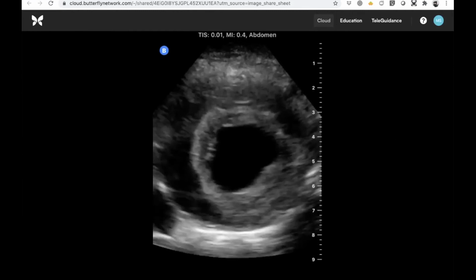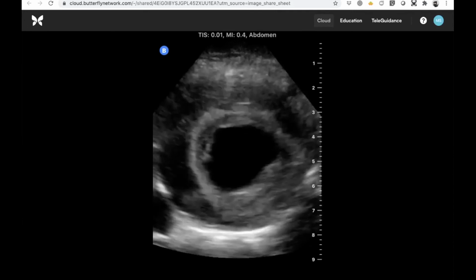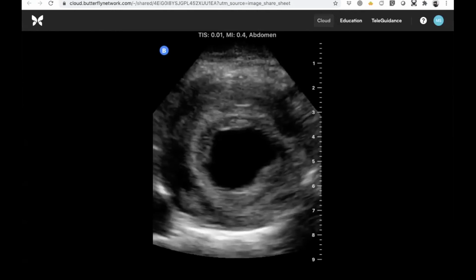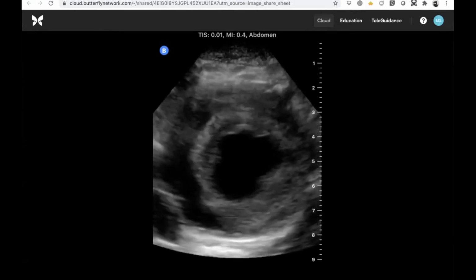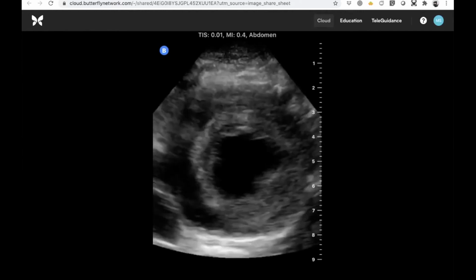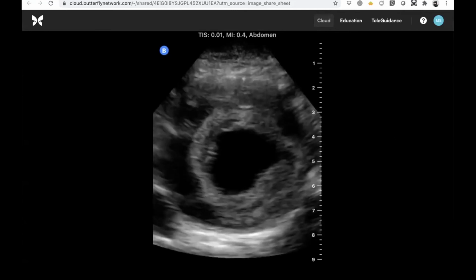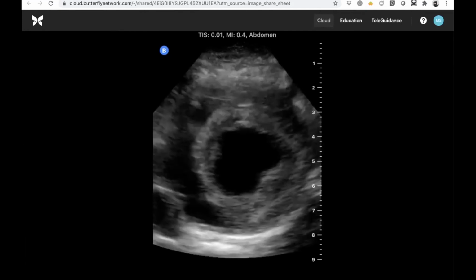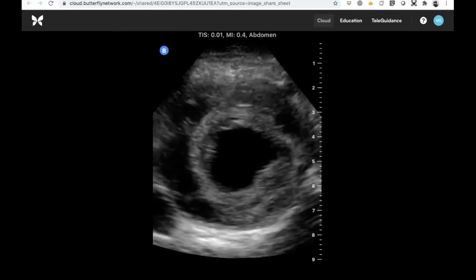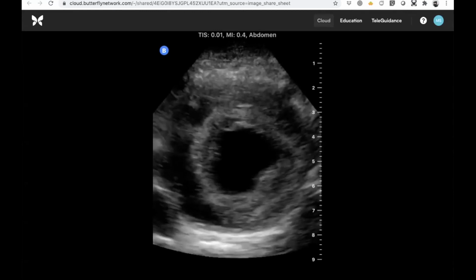Yeah, 100% agree. I worked closely with a trained sonographer who was also a vascular technologist and an ultrasound technologist who said you haven't seen a structure until you've seen it in both planes. And I think that's a great tip. That's the kind of stuff that will stop you from calling something an abscess when it's actually a thrombosed vein. If you just followed it all the way through and then turned, you'd say, wait a minute, this is a longitudinal structure. This isn't an abscess, right?